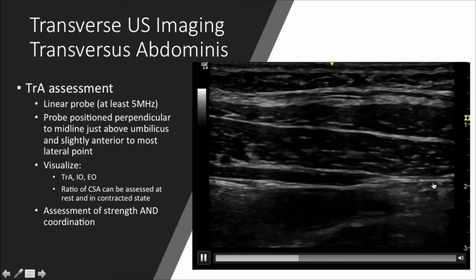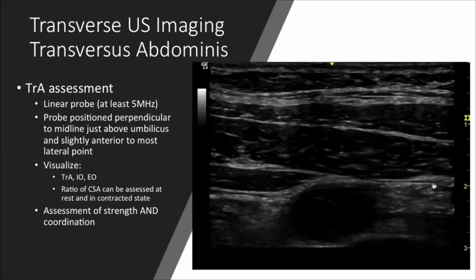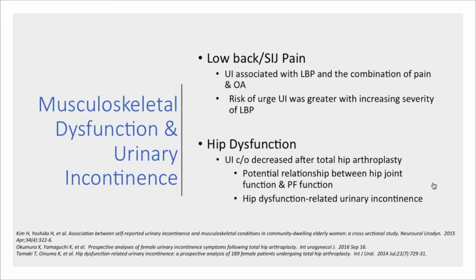So here's a nice contraction where you get that fascial slide and that transverse contraction without a lot of internal oblique carryover.